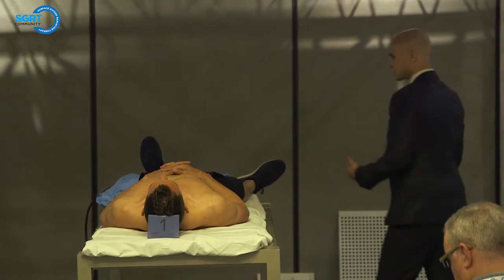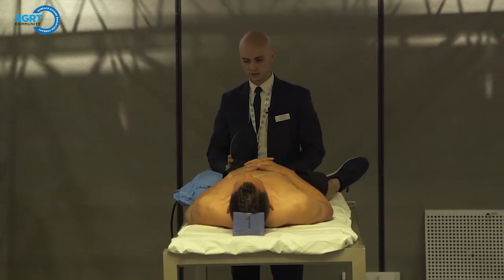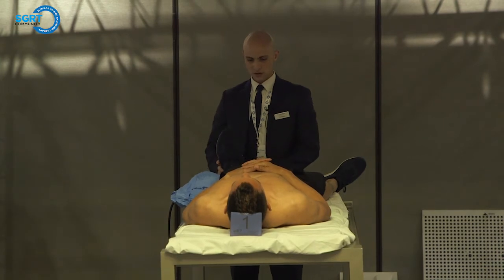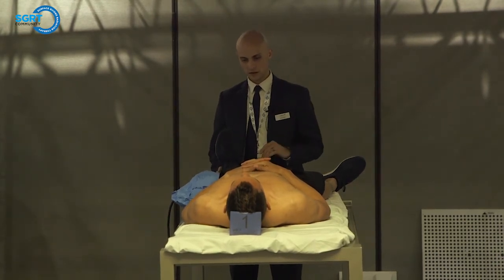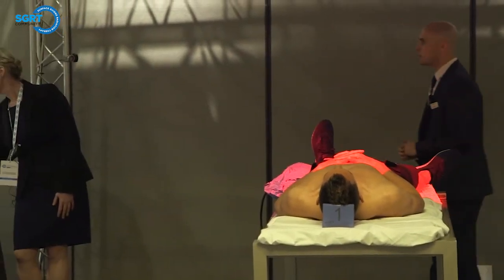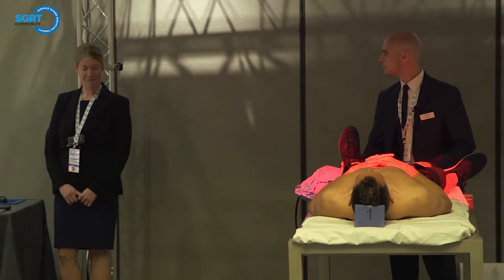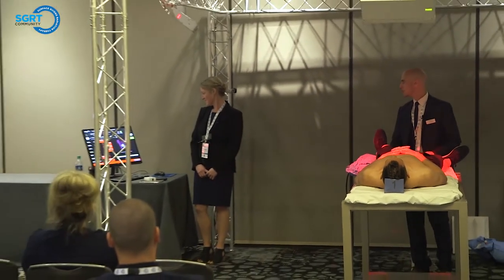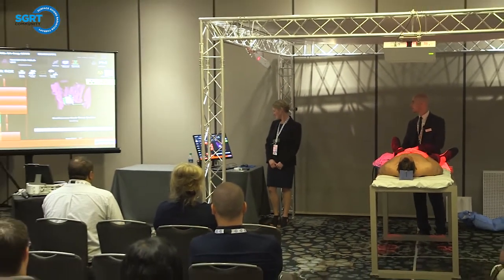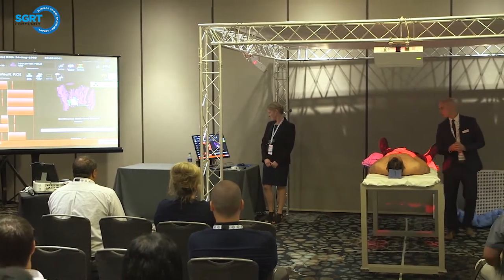So what I'm going to do is, Tim, go ahead and just lift up your leg. I'm just going to get this around where it shouldn't be. Okay. All right. Okay, so let's go ahead and begin monitoring. So if we begin monitoring, man, I did not do a very good job messing you up. Go ahead and bend your knee just a bit. Okay. So let's say that's something we were looking at to set up our extremity, okay?